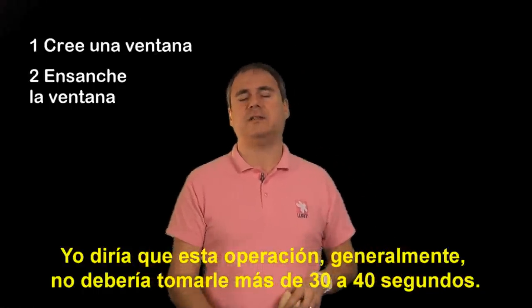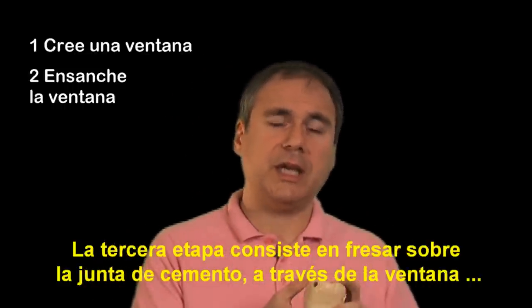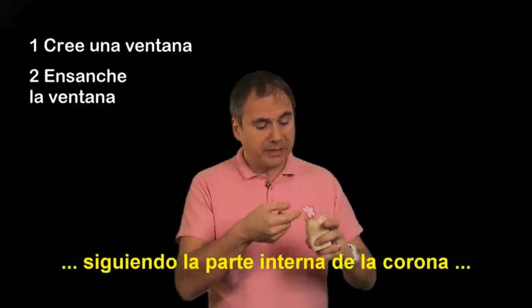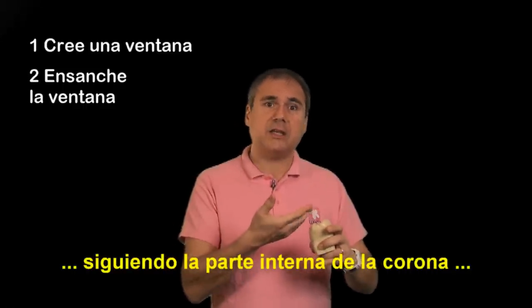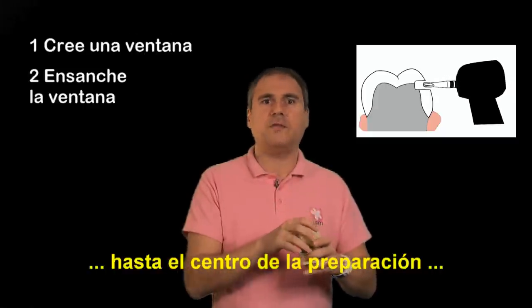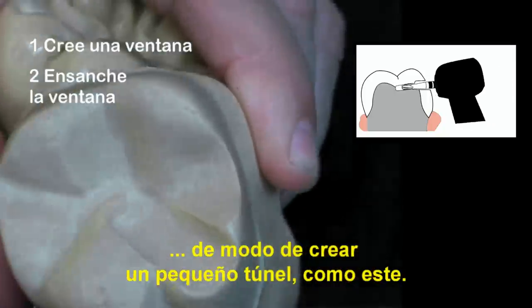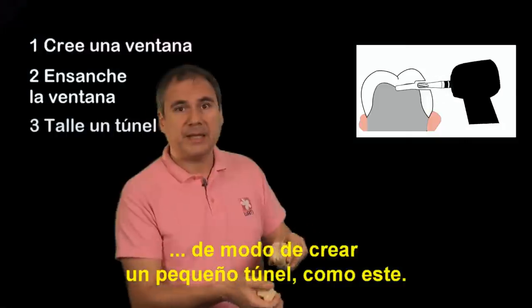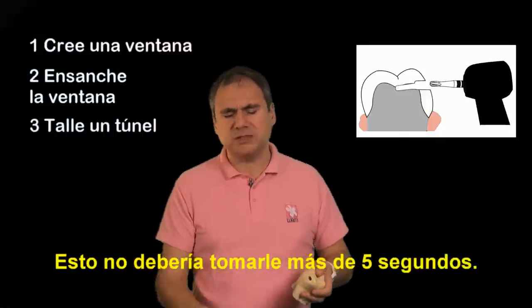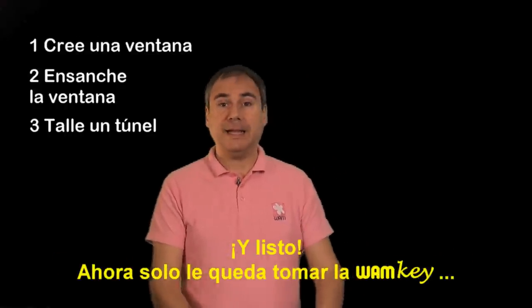Usually I would say that this operation will not take you more than 30 to 40 seconds. The third step consists in drilling into the cement through the window and following the inner side of your crown down to the center of the prep, in order to create this little tunnel. This operation shouldn't take you more than another five seconds.